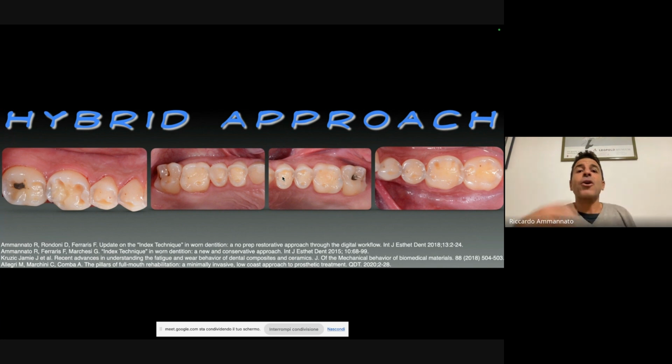Because I know that also composite, which I use a lot, has pros and cons. The pros are that it's very easy to use, is repairable, you can do no prep, you can mold it, you can repolish it easily. Again, it's something that overall is sustainable. However, even if it has grown a lot, still today it's not as stable from an occlusion perspective as ceramic. We know that from the data. We have seen some lectures today before that were stating this.